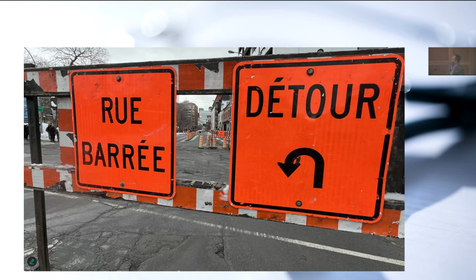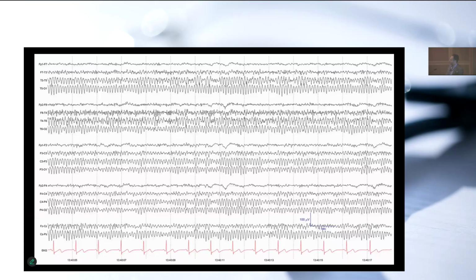So I'm gonna take a small detour for a second and just introduce a way of looking at the EEG so that I can show you some other stuff, because without this kind of technological point, it becomes very hard to consume some of the research in anesthesia. So if I give you an EEG like this, well, that's fine. This is 14 seconds or so of EEG. That's quite fine. And the way we look at these in clinical practice is we scroll through and we scroll and we scroll and we scroll to look at EEG morphology.